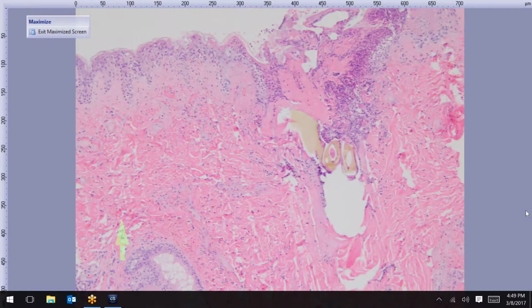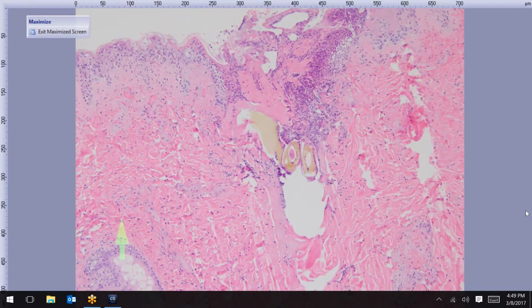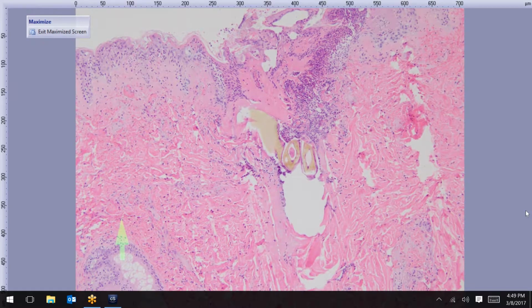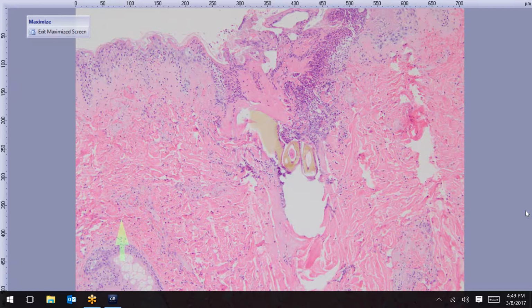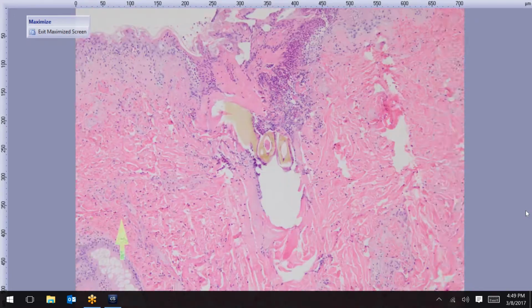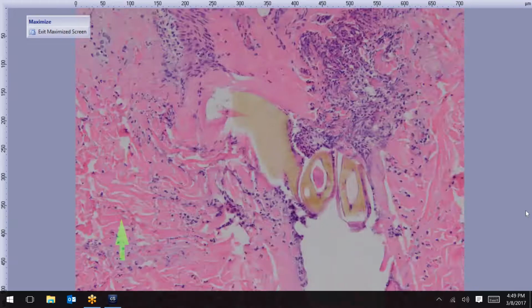This was his last bite. It's me trying to be funny. So this is a tick bite. So somebody had a sort of a retained tick part, and then they really took almost an excision of it. I don't know why they took so much tissue. But anyway, this is, for interest, just a tick mouth.